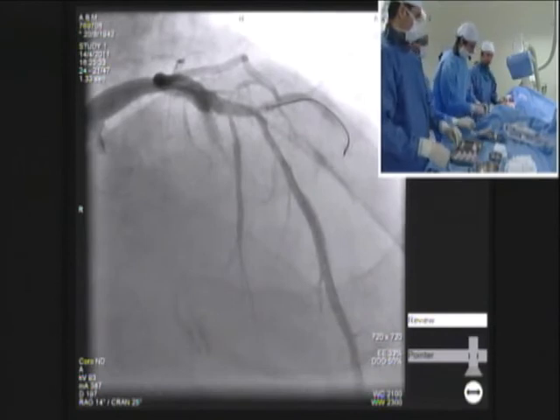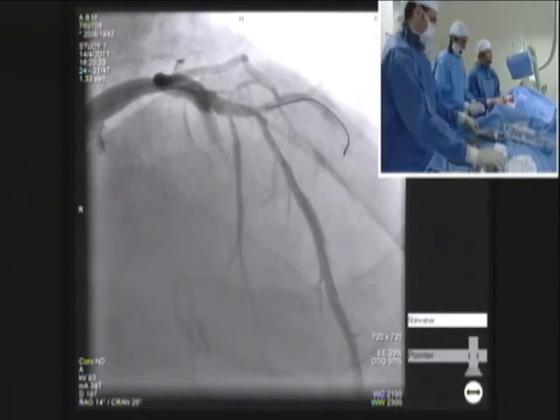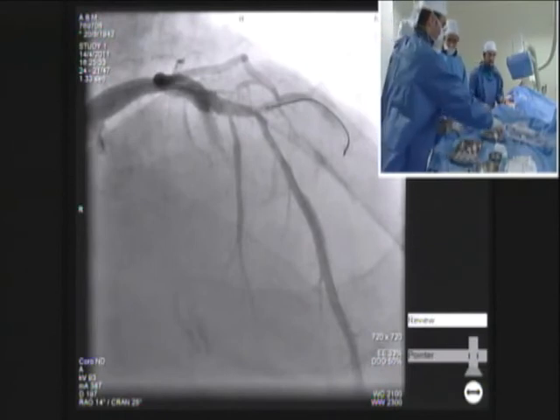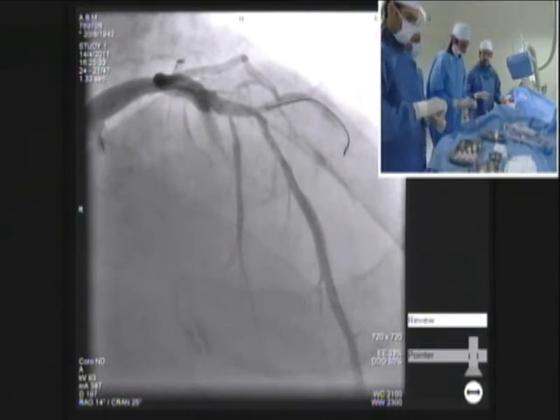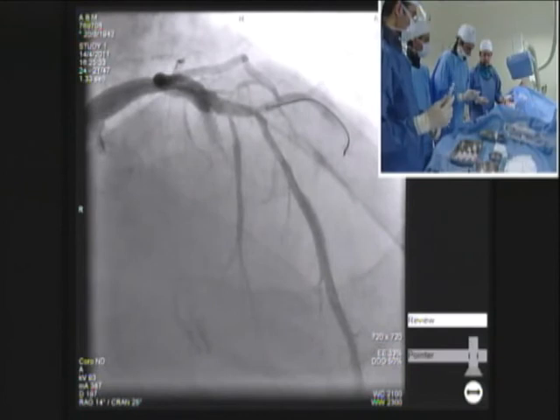I'm more prone to IVUS, as everybody knows, but particularly for this case, I'm more interested in the IVUS post-intervention. I want to see perhaps the ostium of the side branch, if it's patent, if they have a good expansion. Sometimes IVUS changes my procedure or my strategy beforehand, but for the sake of time, I don't think it's going to add dramatically to this case. I don't know what you think.